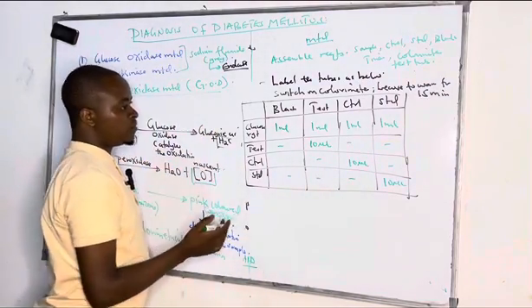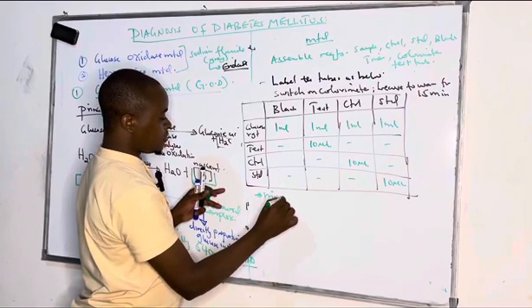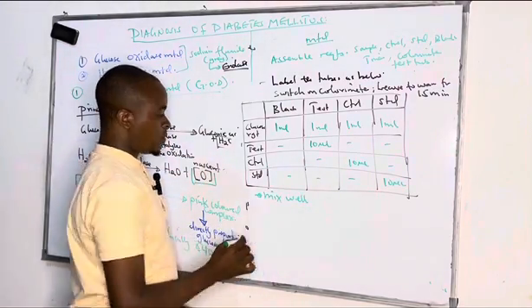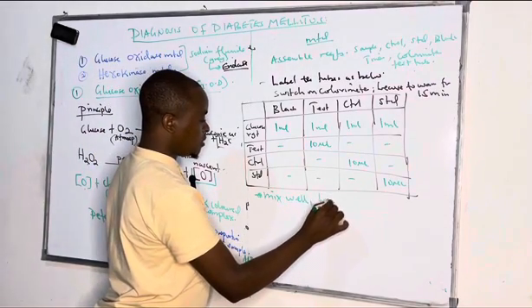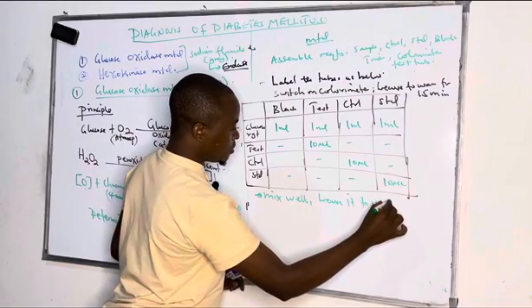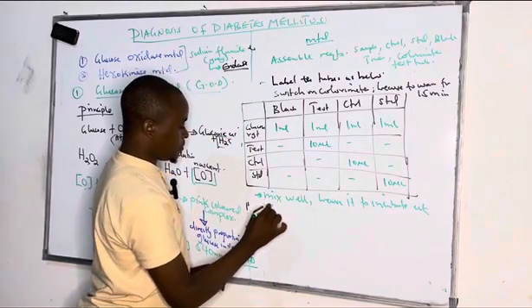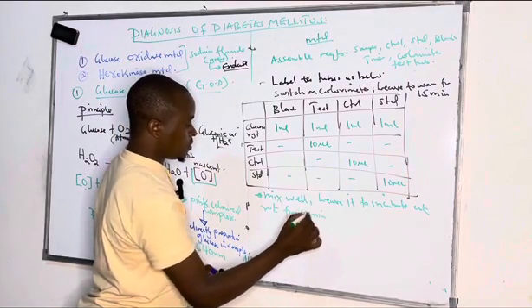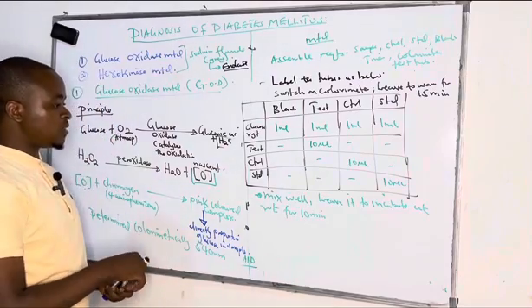After adding them, you mix well. Here, mixing is very important. Mix well the solution, and after mixing well, you leave it to incubate at room temperature for 10 minutes.